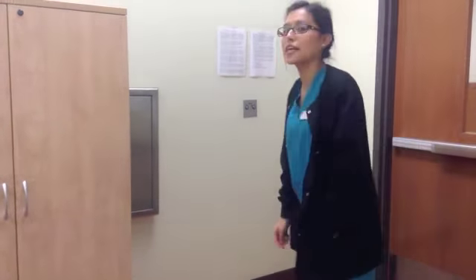Okay. Put a bib over here. All right, Ms. Ramos, we're going to take your blood pressure now. Okay. I'm going to need your left wrist. And if you could please move your sleeve up. Thank you. Okay. And place your hand over your chest and cross your legs, please. Okay. Perfect. 120 over 80. Okay. Is that normal? That is perfectly normal.